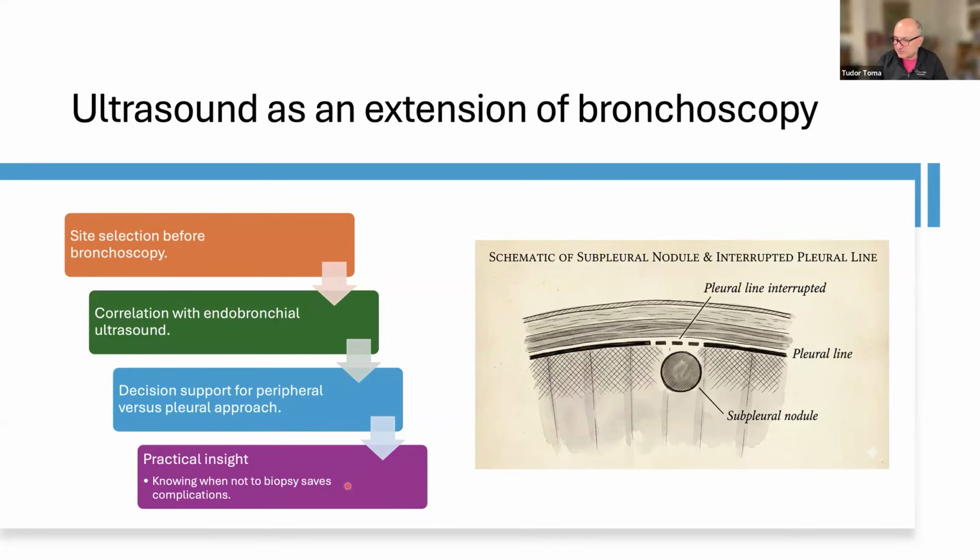And one other thing which I need to add, which is also interesting and important, with the advantage of having now more and more the use of single-use bronchoscopy systems, we can actually use safer single-use bronchoscopy in remote areas where there isn't a bronchoscopy room, where we don't have access to radiology after a procedure, if we have a pocket ultrasound with us.